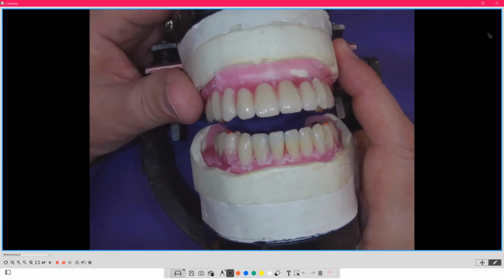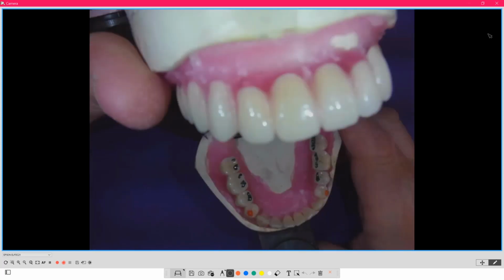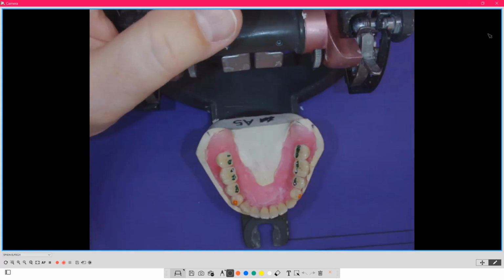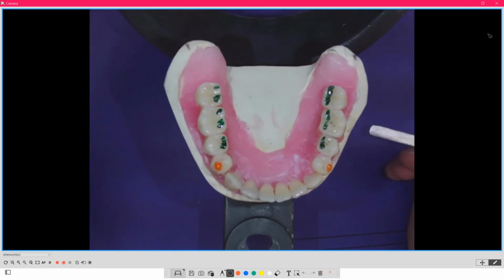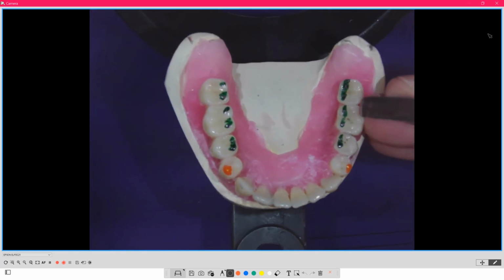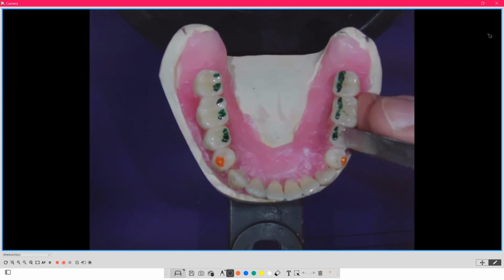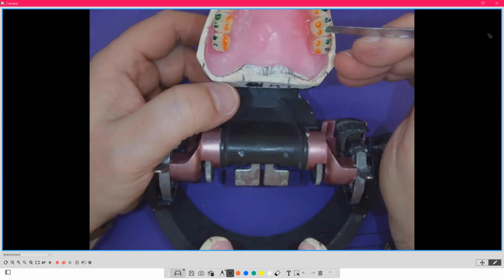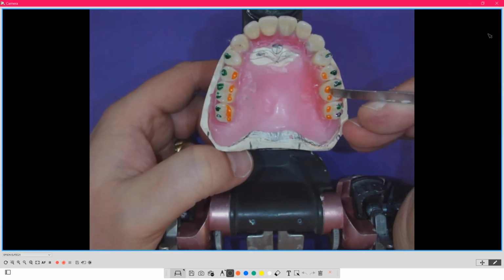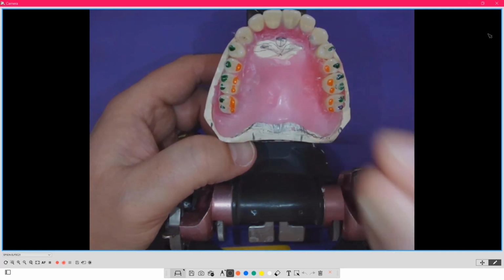And now I'm able to, again, mimic a chew cycle, and then I can check, because now I've marked the teeth, and now all of a sudden these little marks are showing themselves on the guiding planes, which means now I know that there was a hit and slide, and I'm able to adjust these teeth to function better for the patient. So that's how I check it in a lab.